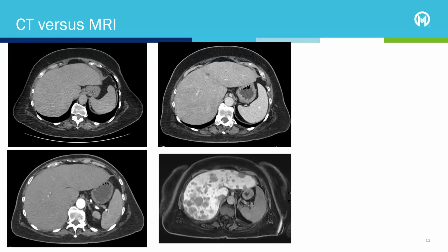But neuroendocrine tumors are a very heterogeneous group of tumors. And so there are some patients that we don't see their tumors very well with CT, or sometimes even more commonly after different types of therapy. We have a hard time telling what's going on by CT, and so we'll get an MRI, or there's a quote unquote lesion that we can't tell if it's benign or malignant, and MRI can sometimes give you extra information.